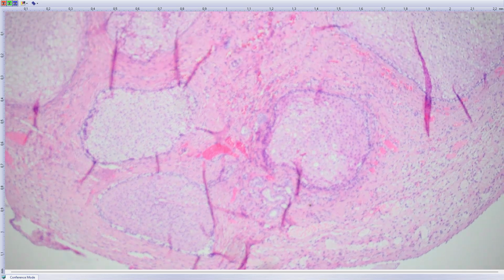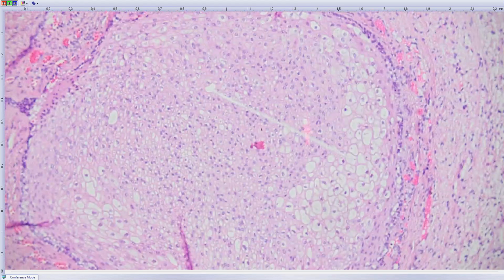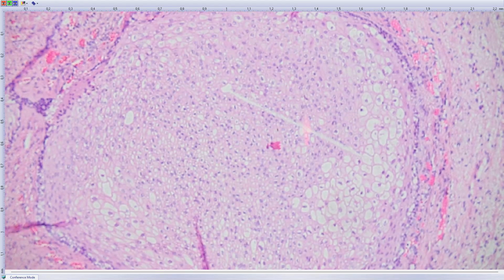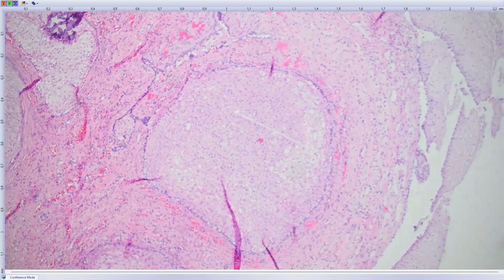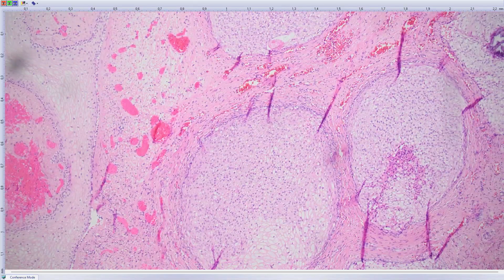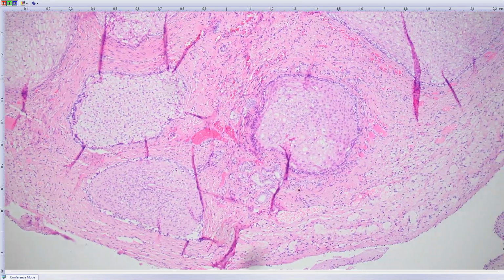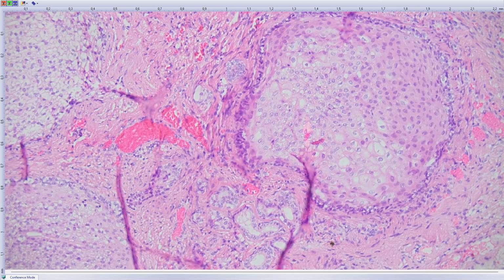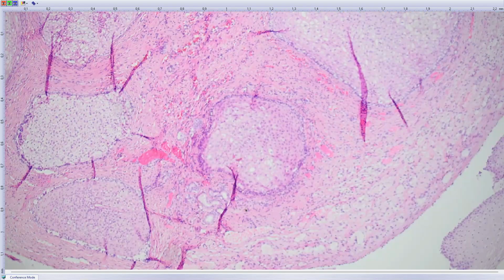The differentiation always looks like this, a mosaic-like pavement of squamous cells. And very often this squamous epithelium has inclusions of prostatic glands. I'm sure it will be here as well. Yeah, I tried to look closely, but I didn't find anything persuasive. Maybe, I had one in my slide, but you can see it's closely, intimately associated with the squamous epithelium. It's very close to it, so it might be arising from it. So, tubulosquamous polyp.